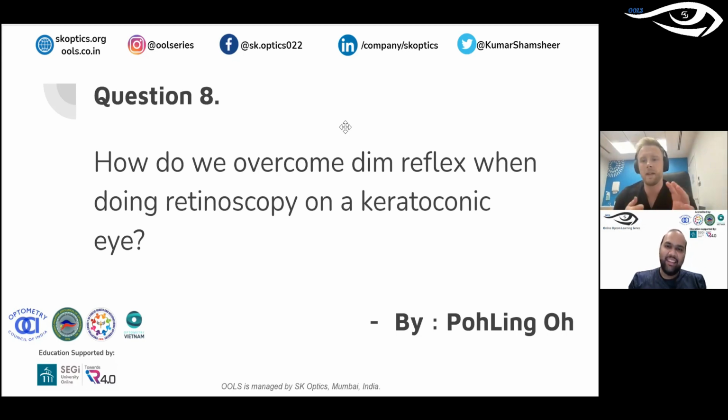So once you get it and you know your working distance and you're confident, just pull back a bit and see if you get a negative result or an against movement. It's a good help. Yeah, that's great. I think that's a great tip. Adjust your working distance and see whether you are getting that reversal, to see whether that was neutral or not as well, right? Yeah.